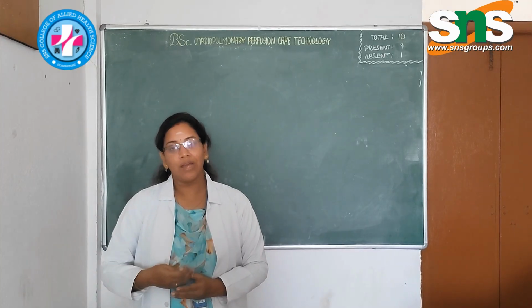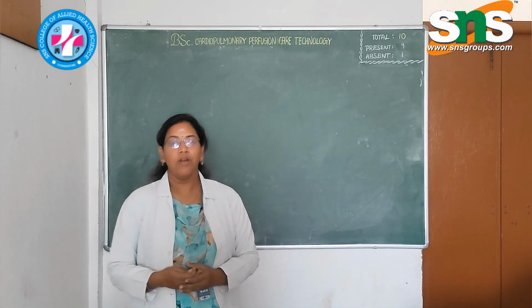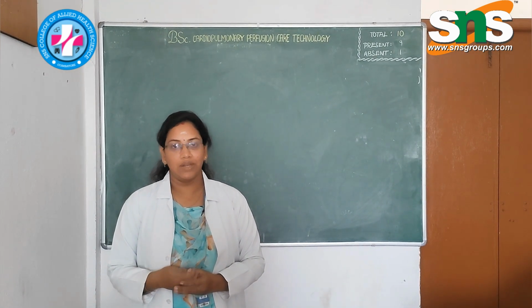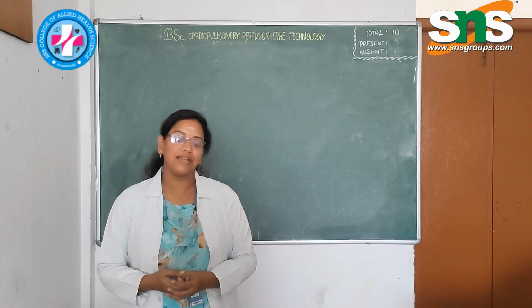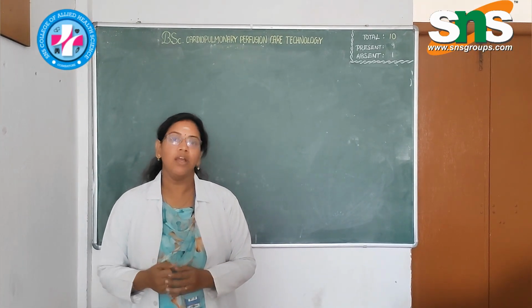So it is planned to have a VA ECMO, that is called Veno Arterial ECMO. Why it has been done is that the patient needs cardiac output support as his ejection fraction is very low, and his heart and lungs both need a rest for a few days to cope up and enhance its ejection. For that purpose, the doctors have planned to take the patient for a VA ECMO.